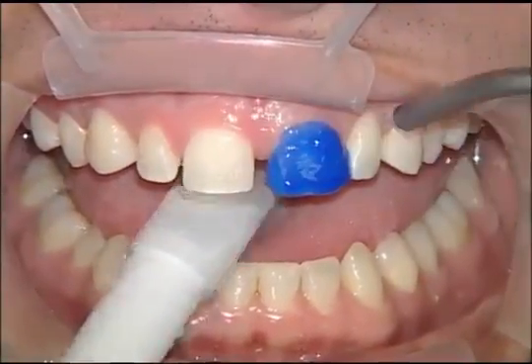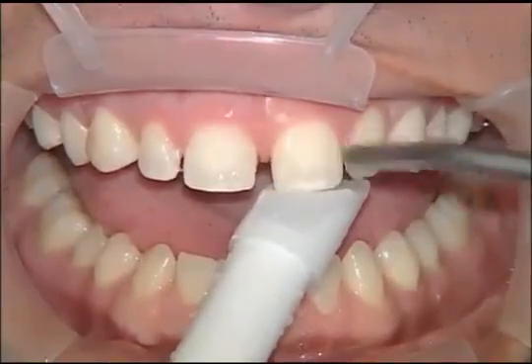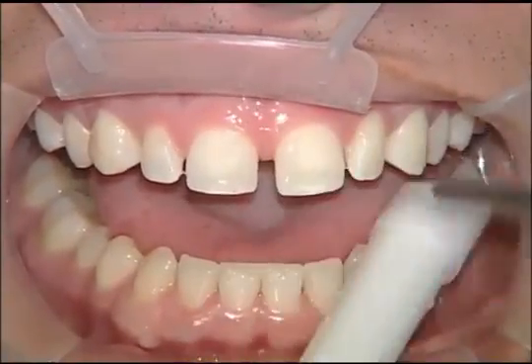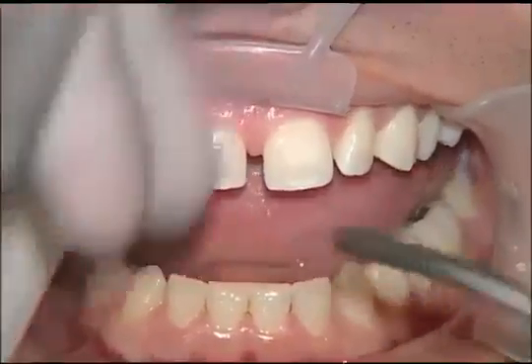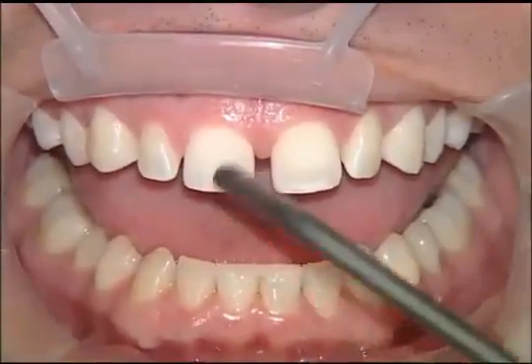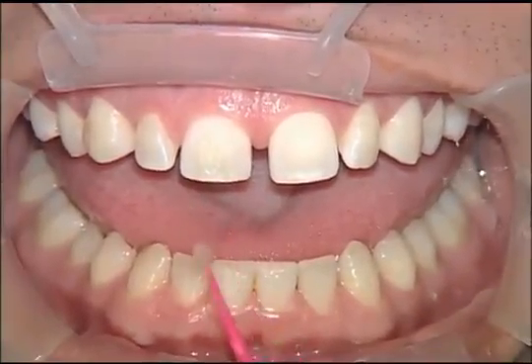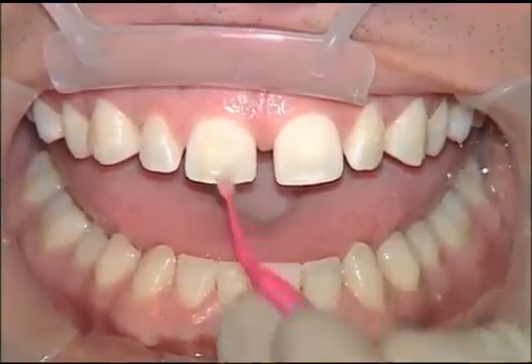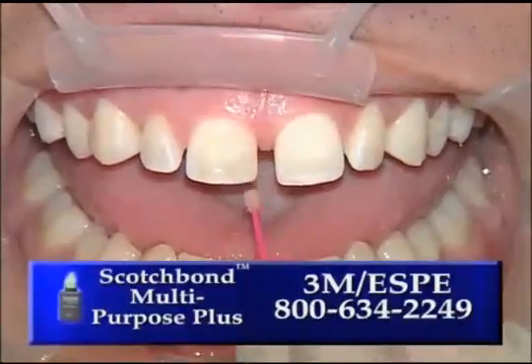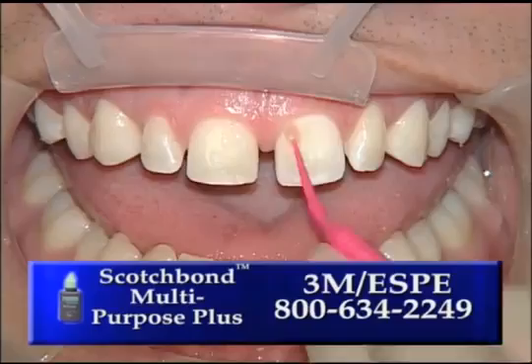We're going to go ahead and rinse off the 37% phosphoric acid. As you may have noticed, we have only etched the central incisors so far. And as we air dry this, you'll notice that we see that frosty appearance that we're used to from the old days of bonding when we were primarily etching enamel. What we're placing here is not your typical dentin bonding agent. This is just the adhesive from the Scotch Bond Multi-Purpose Plus kit. And because we don't have any exposed dentin, we can just use the adhesive. There is no need for primer.